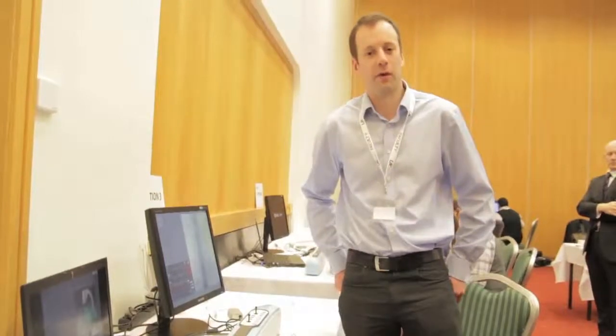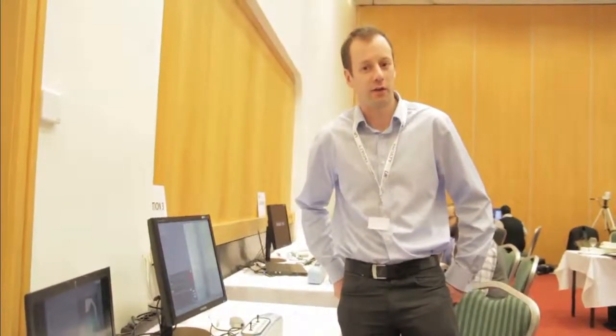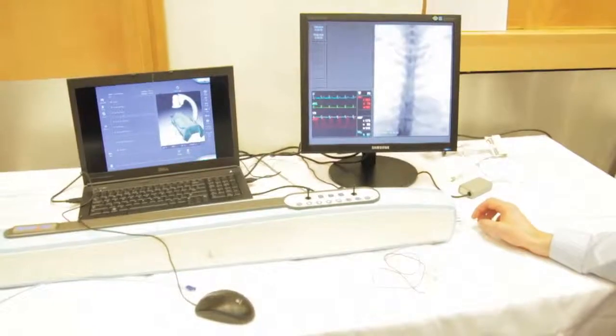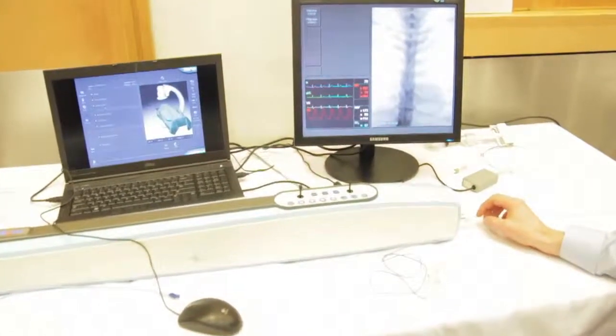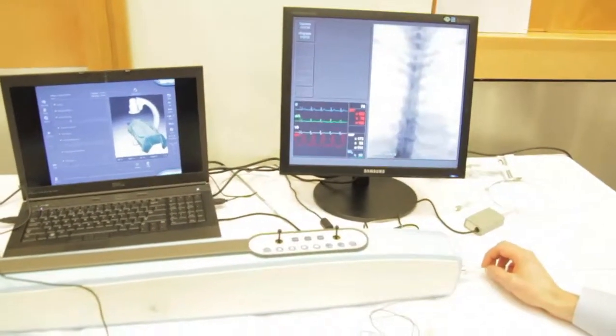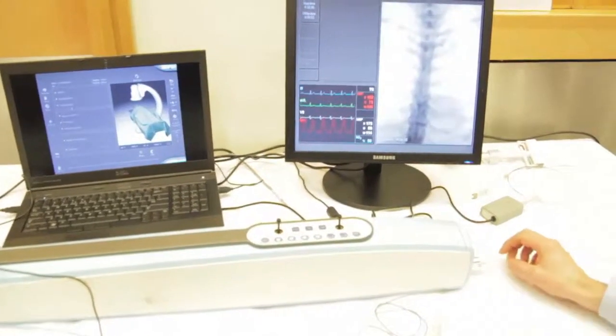Good afternoon, I'm Rob Williams, one of the interventional radiologists and the lead radiologist for the UKETS course. I'm going to give you a quick demonstration of catheterizing the left common carotid artery and a demonstration of arch angiography, specifically selecting the left common carotid artery after doing a standard arch angiogram.